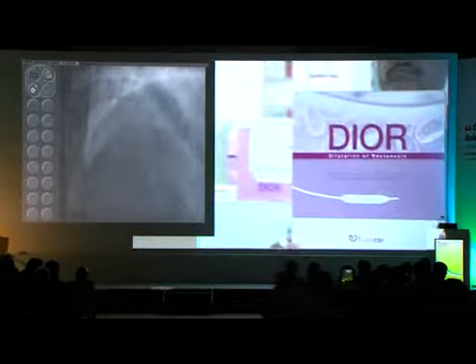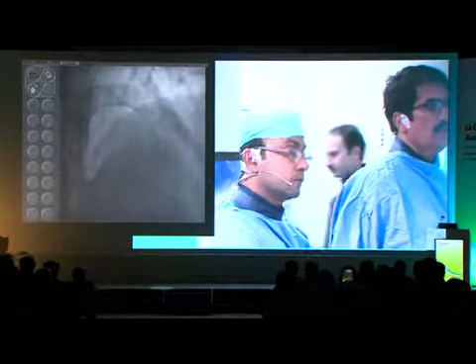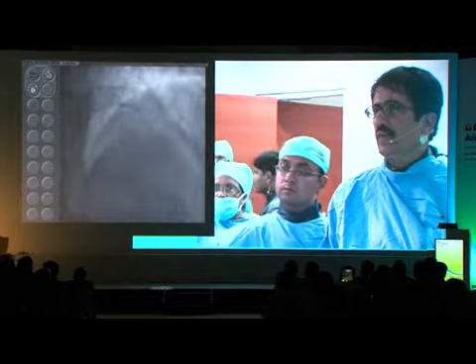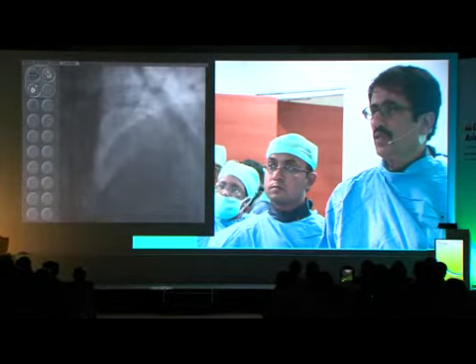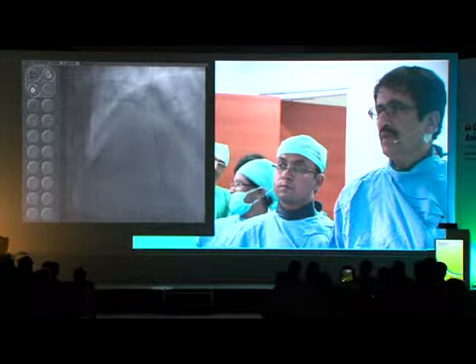Shirish, do you use intracoronary nitroglycerin in these patients, like this situation of diagonal? No, actually, that's why I showed you the lesion prior to the procedure, and there was a lesion in the mid portion always. So it was not a spasm. We are quite certain of that.